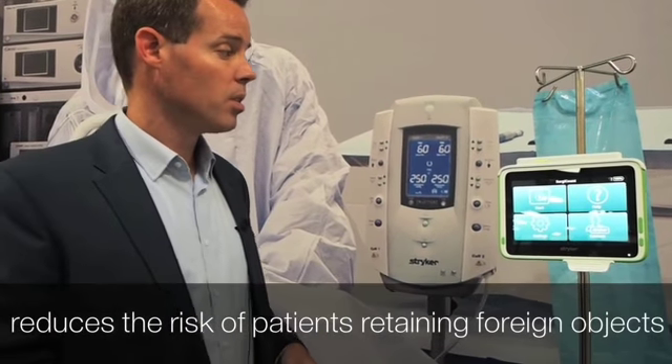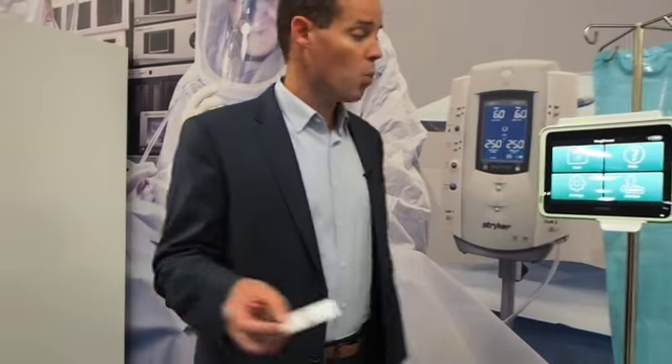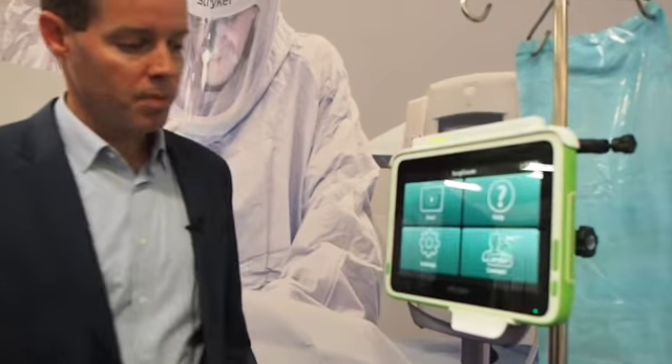It's a really safe, simple, and effective system. When the nurses are setting up their room before the patient comes in, they need to do surgical sponge counts. What the circulator nurse will do is they'll have a badge, they will walk over to the surge count tablet, they'll simply press the start button, and then the system wants to know three things.